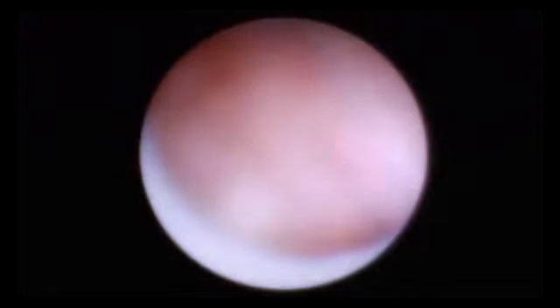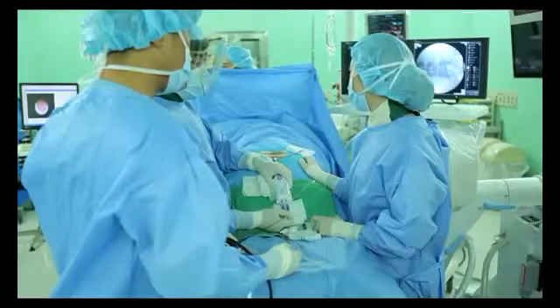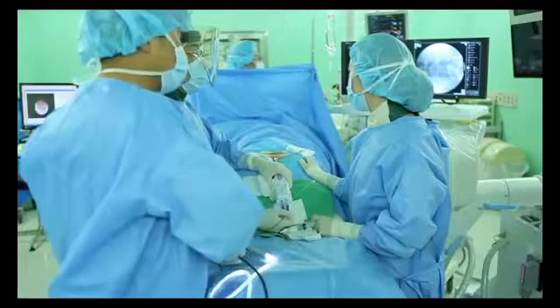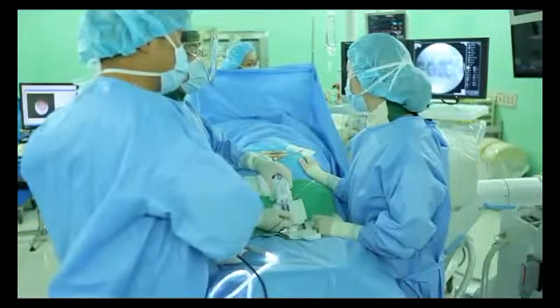After you are sure of the target point by stimulation, you may start lesioning at 5 watts and increase the laser power up to 8 watts for lesioning, as long as the patient does not complain of either severe leg pain or muscle contraction during the laser firing. If the patient complains of severe leg pain, you should doubt wrong placement of the laser fiber and be required to adjust the laser fiber.